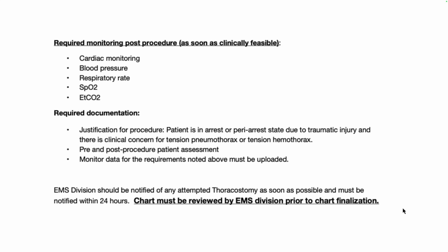Okay, after the procedure, we need to make sure that we're monitoring cardiac, blood pressure, respiratory rate, saturation, and tidal CO2. All of those need to be done as soon as clinically feasible. If you can't get to one for some reason, document why you couldn't. Just document that, hey, we got all these other things done, but our hands were full. We didn't get around to X, Y, or Z. But these should be pretty straightforward. We have enough hands on scene that we should be able to do this.